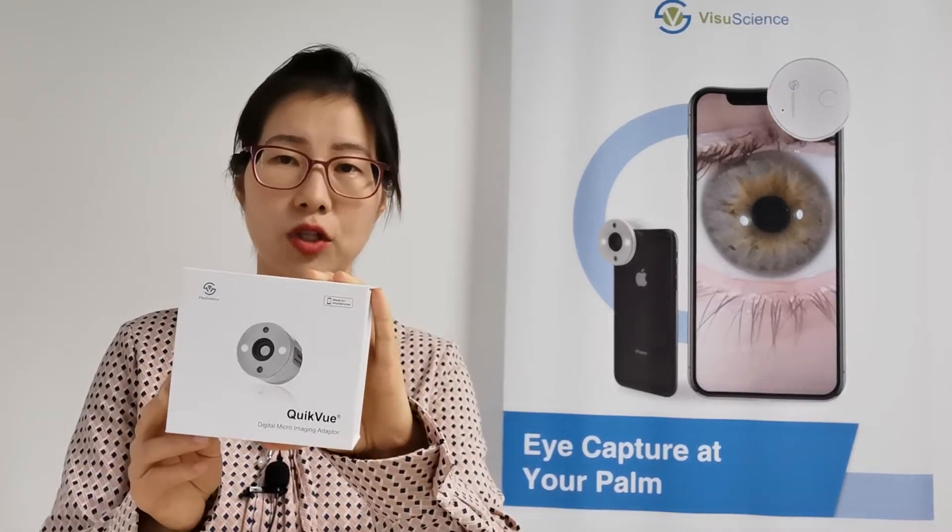Hi everyone, this is Sarah from VisualScience. I'm the Sales and Marketing Manager for VisualScience. Today, it's my pleasure to give you a presentation about our QuickView smartphone eye imaging adapter and QuickView filter kit.